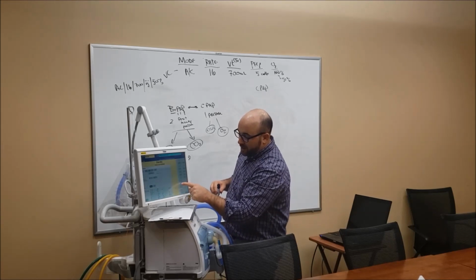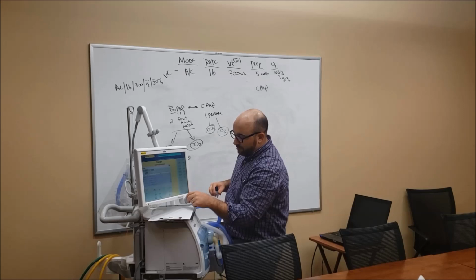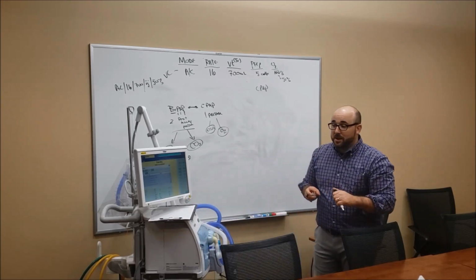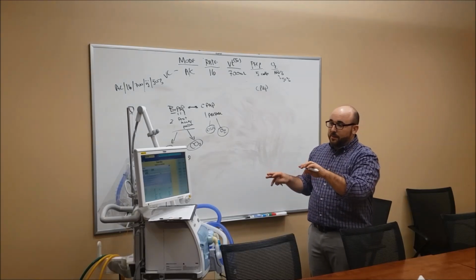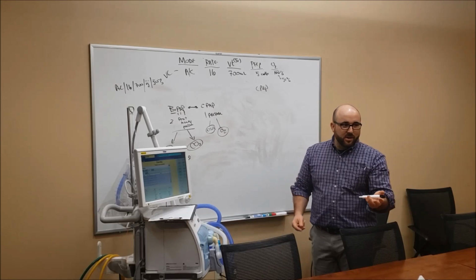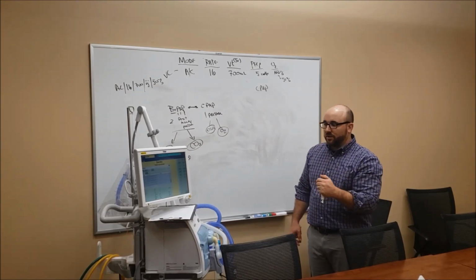You touch this button right here when it's highlighted, and then touch and confirm. And the oxygen button is really cool because what it does is silences the alarms, but then it pre-oxygenates them like we're supposed to do, right? To prevent any kind of ectopy. So it pre-oxygenates, silences the alarms for us.